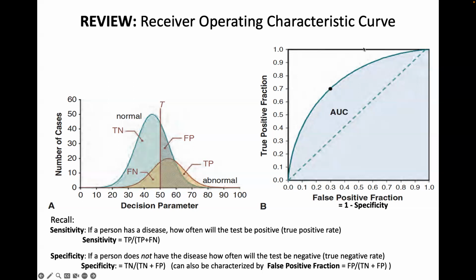So generating a curve that moves as far to this left corner as possible is essentially the quality metric that we would like to optimize our imaging on. We would like to run some optimization. Say I'm going to change the energy of my X-rays in my coronary artery images and see how that affects my ability to predict people having a heart attack.